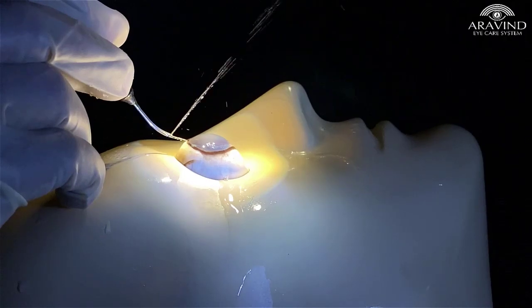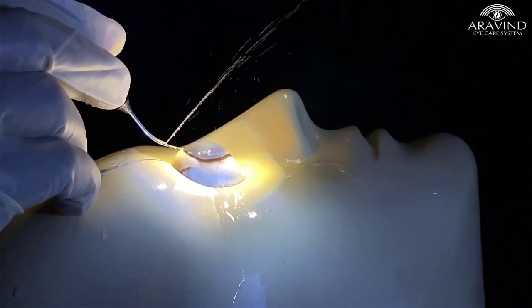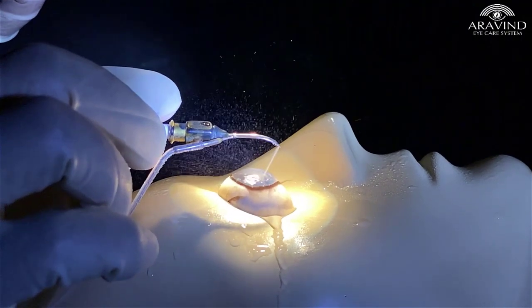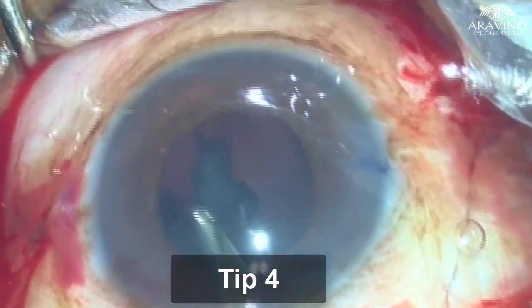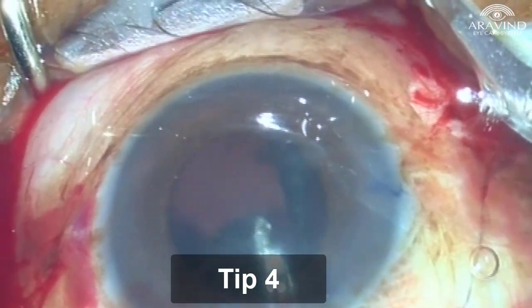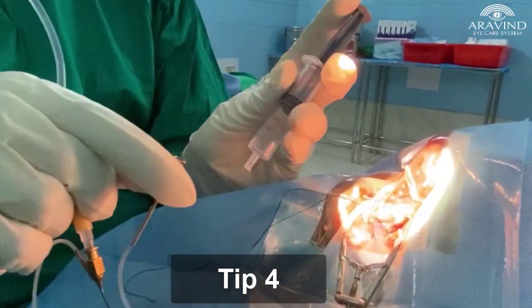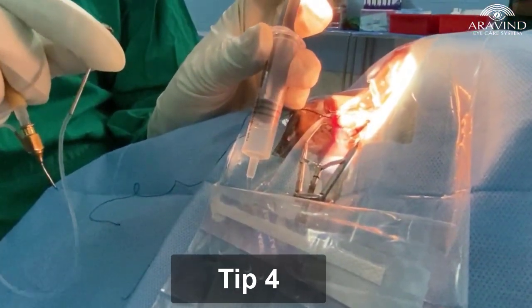The video clearly demonstrates aerosolization while flushing out fluid through a Simcoe cannula. If we try to empty the aspirated content by flushing, it generates significant aerosol on touching any surface. If cortex blocks the Simcoe cannula, we should flush it inside the anterior chamber only. Once the syringe gets filled, we should detach the cannula and gently flush out the aspirated fluid directly from the syringe into the drainage bag.